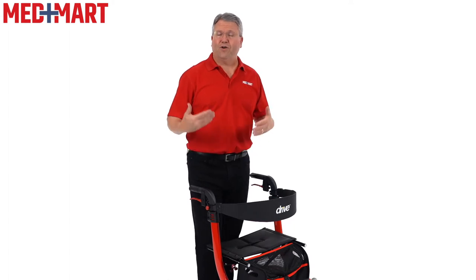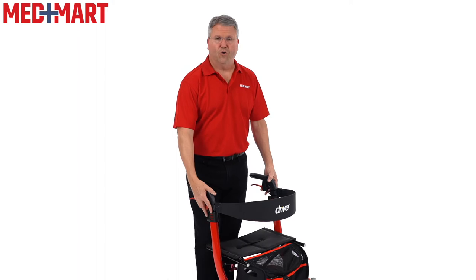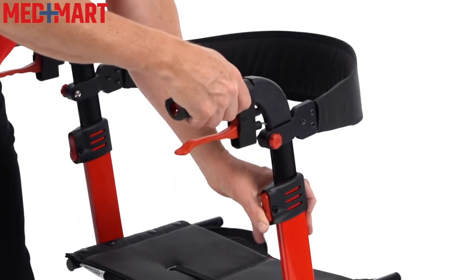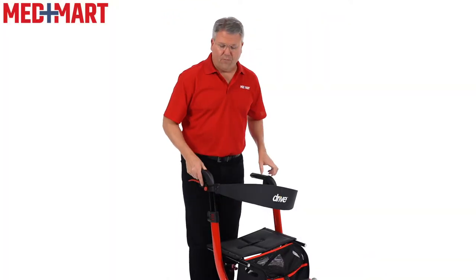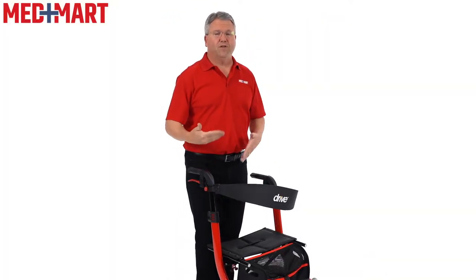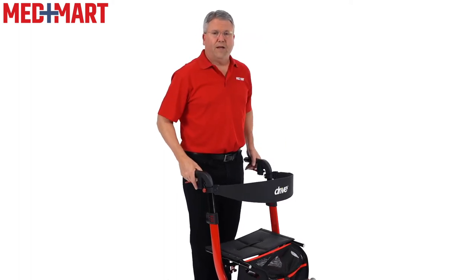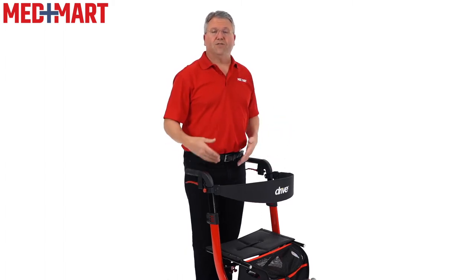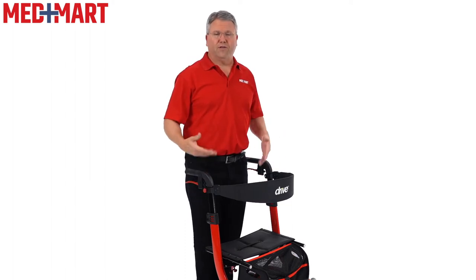When you first get the rollator out of the box, you're going to want to adjust it to your height. This is where it starts at in the low position, and there's about five inches of travel where you can raise it all the way up to the tallest position. For me at 5'10" with shoes on, I find it right about the second from the top. You can see I've got a nice relaxed stance, I'm able to stand upright and easily control the brakes. I would say probably up to about six feet tall this would make a great option. There is also a tall rollator available as well.